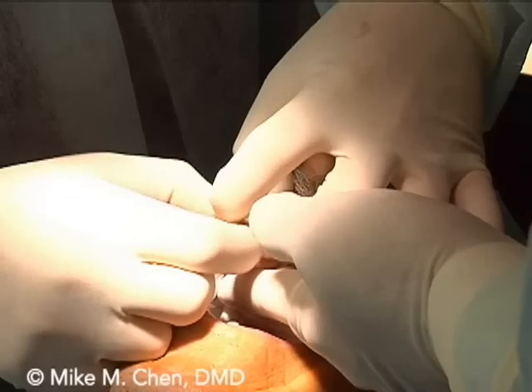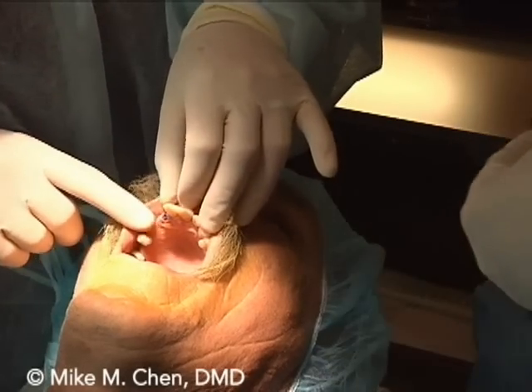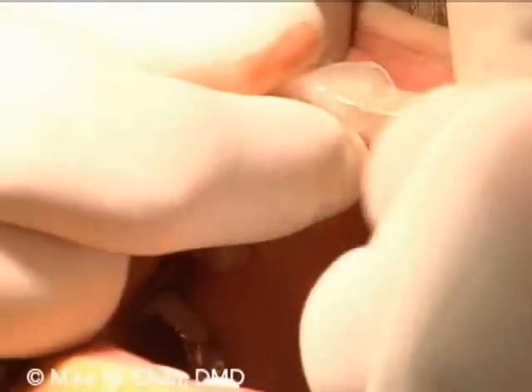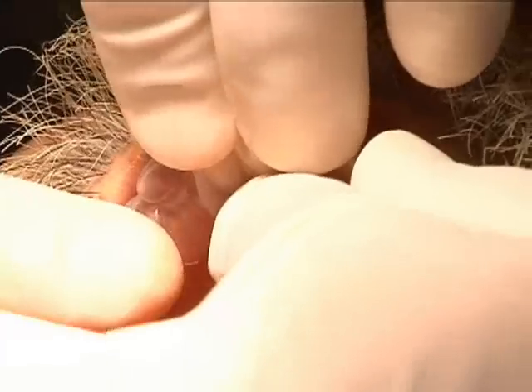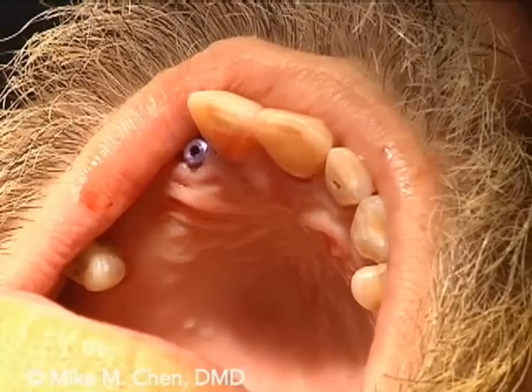And once we've done so, we use the omnivac technique to make the temporary for the patient. And this basically makes it a little easier and faster. And of course, the plastic shell, the omnivac, is pre-made. It's made on a patient study model. And as you can see, the acrylic is inside. The mold of the tooth is shaped. And once that's done, we adjust the temporary.